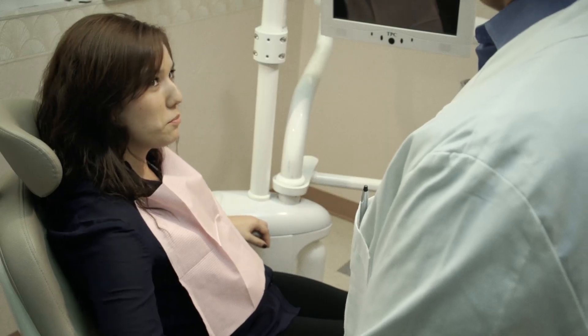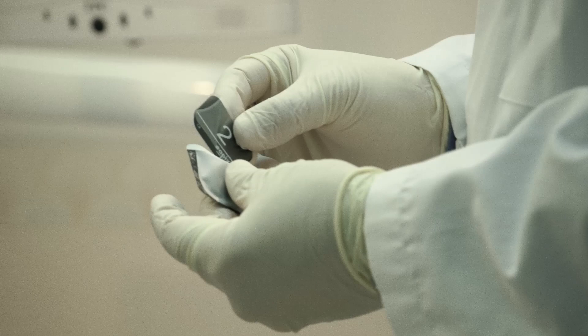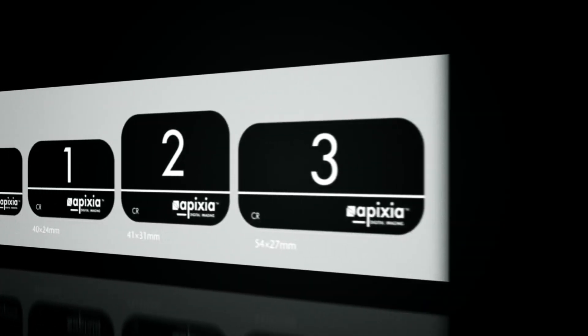Phosphor plates have all the traditional benefits of x-ray film with the speed of high-tech digital radiography. With the wireless Digirex PSP scanner, there's no need for hazardous and costly film processing chemicals. Patient comfort is assured with thin, flexible plates in multiple sizes.